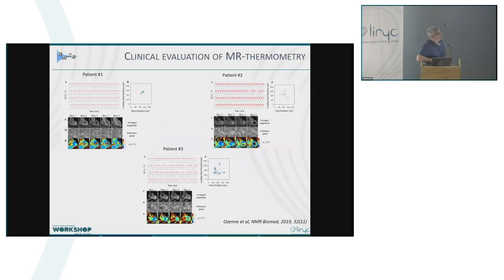These were on animals, and then Valérie did another study on patients at the hospital, because here you also have to deal with patients who are arrhythmogenic. This is an example of the ECG and the images you get with temperature maps, of course without any ablation. We analyzed the stability of the cardiac rhythm by plotting the interval at a given time as a function of the previous one. If a patient's heart is beating completely regularly, you get a single, very localized plot there. Then, in this second patient with a bit of arrhythmia, you can clearly see that this value splits into different areas.